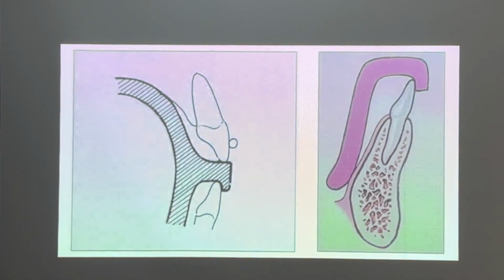We need upper anterior retraction with the functional appliance. At that time, on the lingual part of the incisor area, we need space. So it depends on your decision. Please use a good program. You are the maker of your own program.